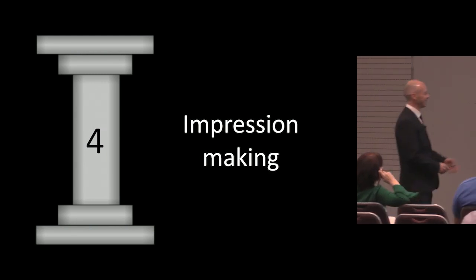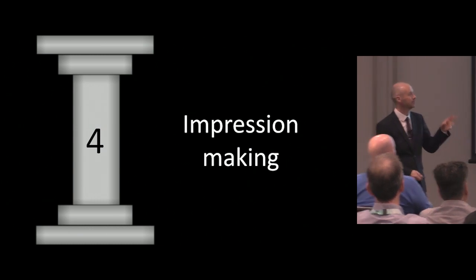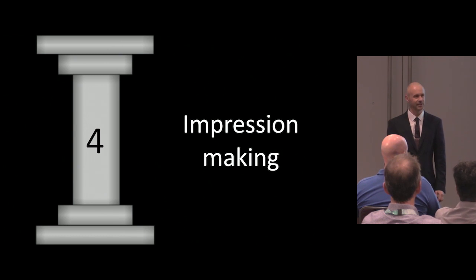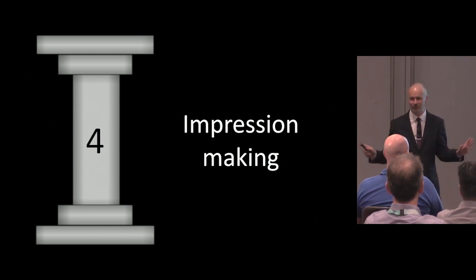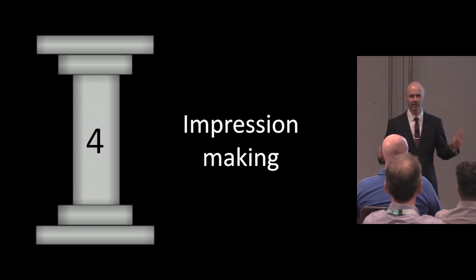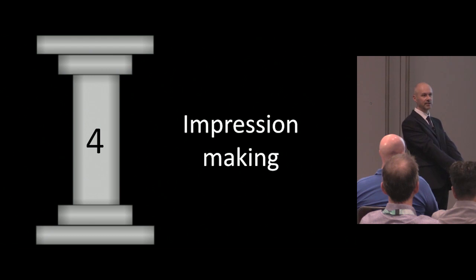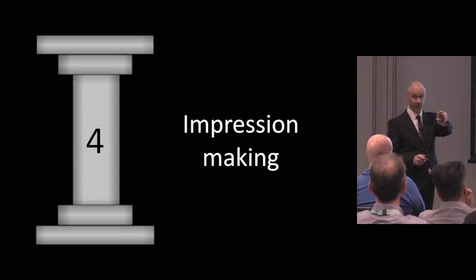Right. Impression making, fourth pillar. It's absolutely crucial that dentures fit and they don't drop down and move around. They could look fantastic, but if they're bobbling about when the patient is talking, then it's a total aesthetic failure, isn't it? So it's absolutely down to my impression making. And it's very much along the lines of Dr. Arbe, particularly for the lower.